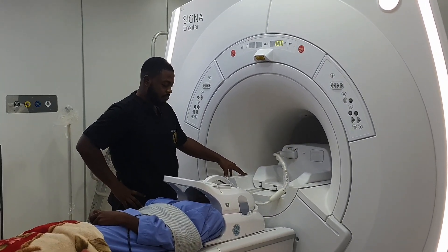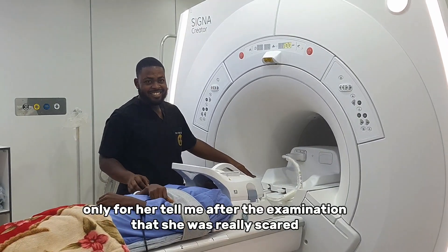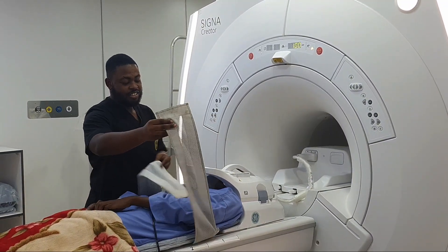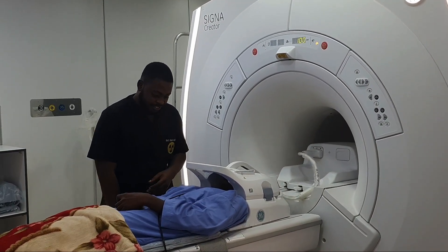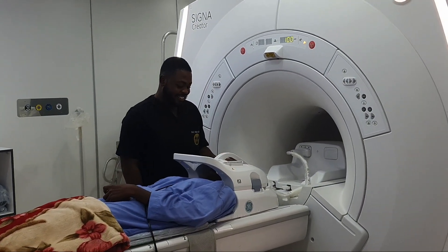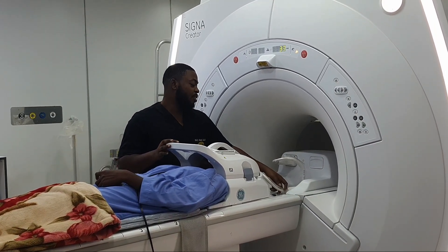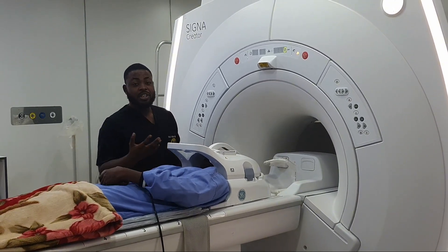Oh my God, I feel scared. Can you release my hand? Just release my hand. Sometimes I try to experience something like this. I feel scared. So this is some of the cases we have with a claustrophobic patient — they usually feel this way.